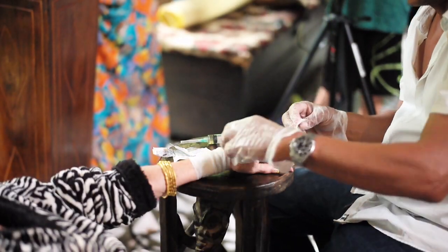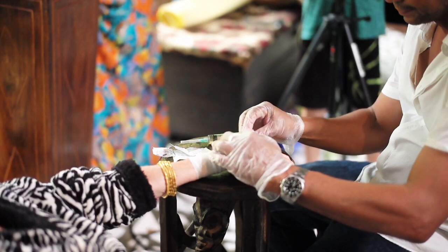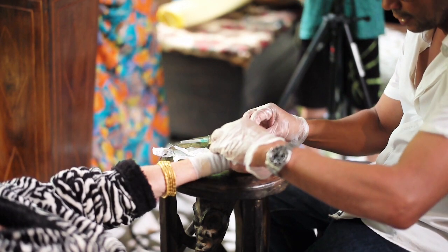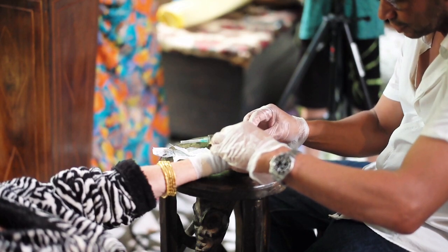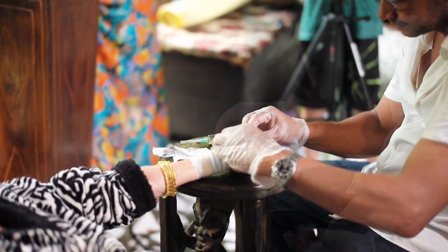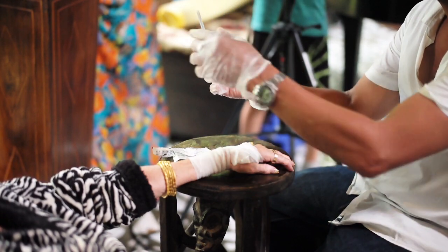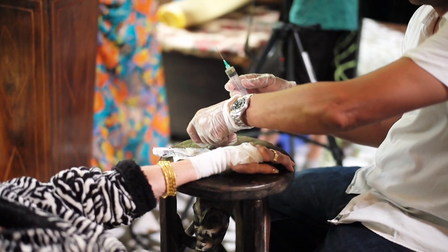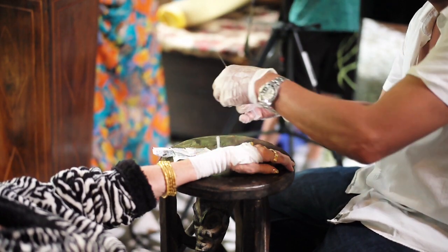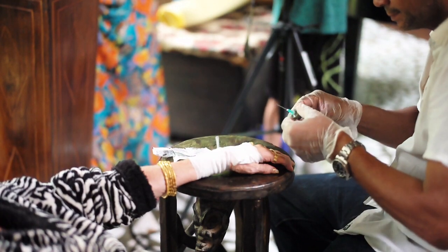Now what we're going to do is, here's the catheter, and we're going to clean the catheter. Wipe it up really good with alcohol, make sure there are no impurities around it. Okay, we have our syringe right here ready with the antibiotics. We're going to take the needle cover off and push it into the catheter.